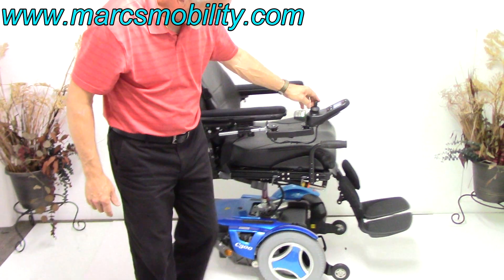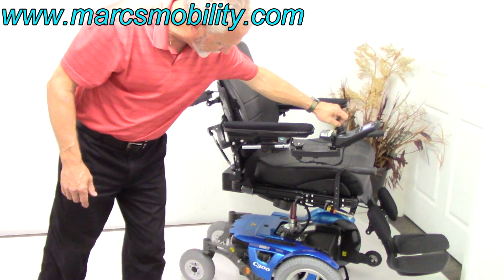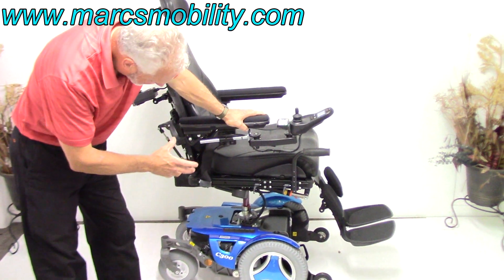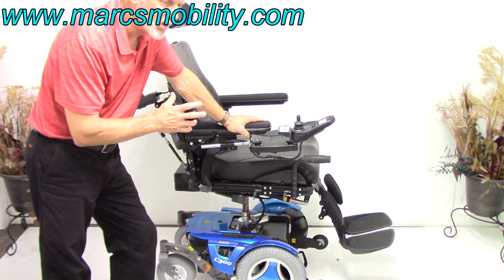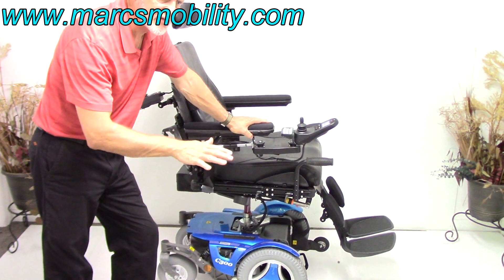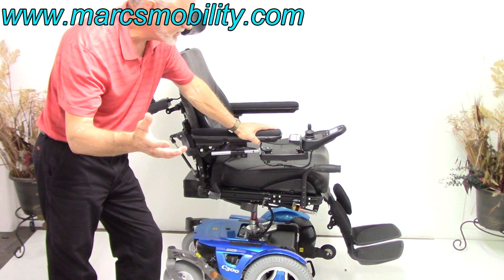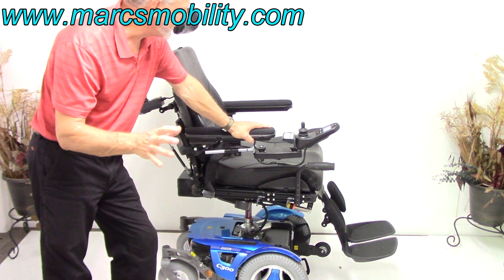I'm going to put it back into drive. This chair will drive with the seat elevated. I don't like driving these chairs with this type of seat lift unless you're on a flat surface and you're careful. It's made to be driven, but I would be careful depending on your height and weight.